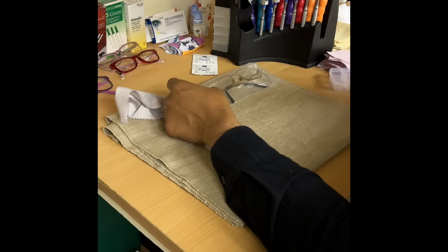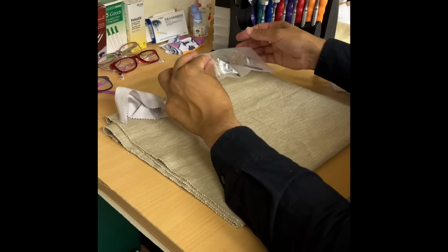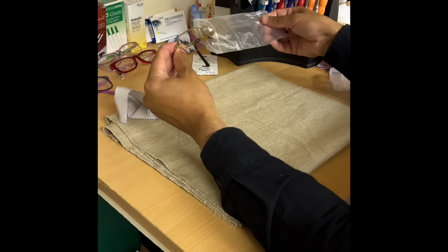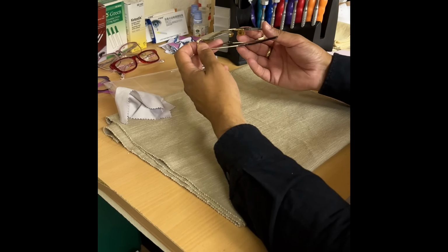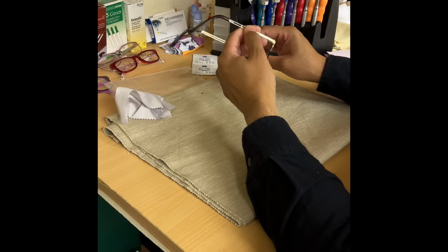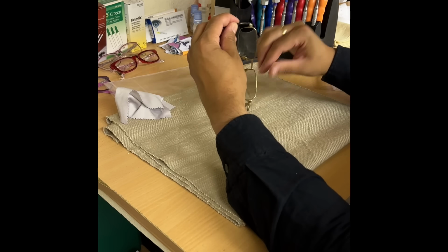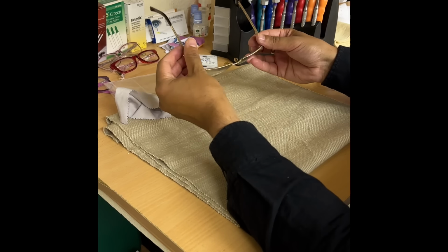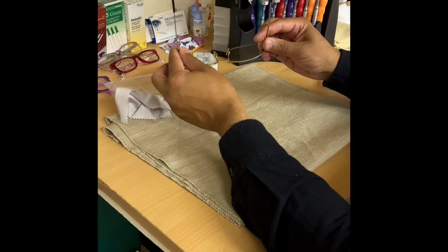Right, what's happened to your bifocals? See, the bend on those is quite dramatic. How have they been fitting you? Okay, let me loosen off the bend there for you, just a little bit, and try them back on afterwards. See how they're doing. So this is a gold supra pair.